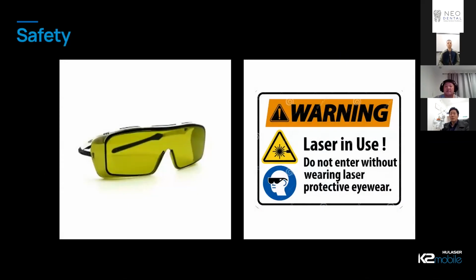So hopefully you can appreciate that there are possible dangers to you and your patients and your assistant and your support staff when you're using a laser. You need to have the appropriate protective eyewear. And one thing about the eyewear is that for each different wavelength, you need a different set of glasses that are protective for that particular wavelength. So if, for example, you're using the K2, which is a 980 nanometer wavelength, but your safety glasses were intended for, let's say, 810 nanometers, then you are going to damage your eyes or your patient's or your assistant's eyes. So make sure that the correct safety glasses are used for whatever laser you're using. It's also important to have a sign on your surgery door to make sure that no one accidentally walks in during the surgery if you're using the laser and has inadvertent eye damage.